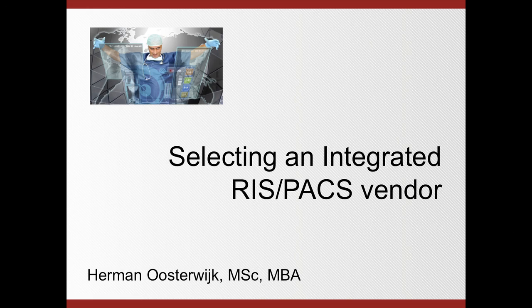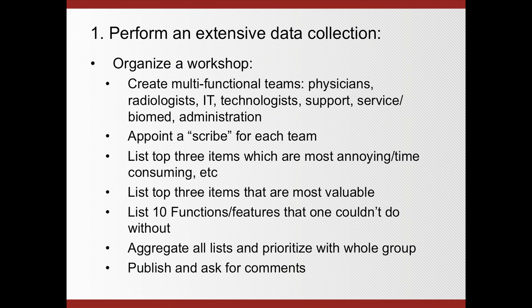So now let's back up a little bit and go over the different issues one by one. First thing you might want to consider about a new system is performing an extensive data collection. When I do this process, I typically organize a workshop, and the workshop might be a whole afternoon, and I would invite all the people that are involved with the current system.